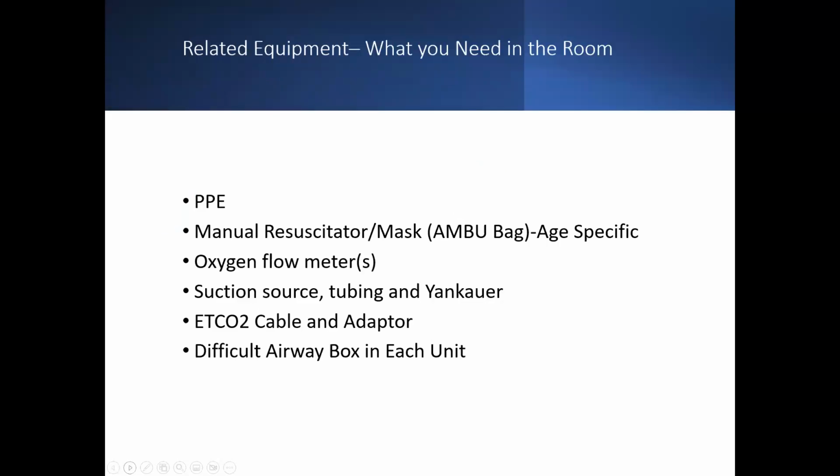Related equipment, what you need in the room. So you need your protective equipment, your manual resuscitator, ambu bag, age specific of course, oxygen flow meters, suction source that includes the tubing and the Yankauer.